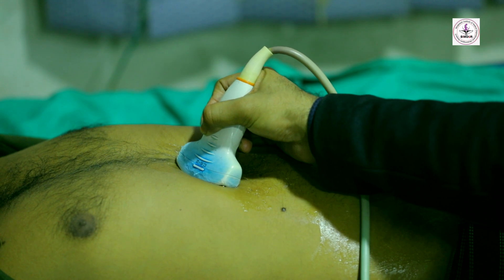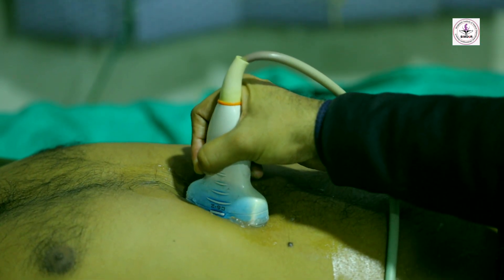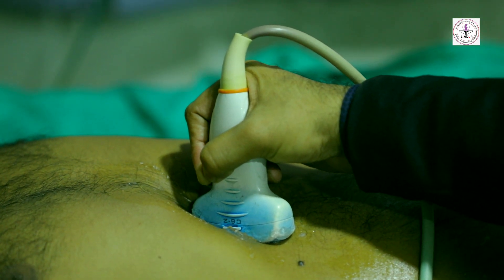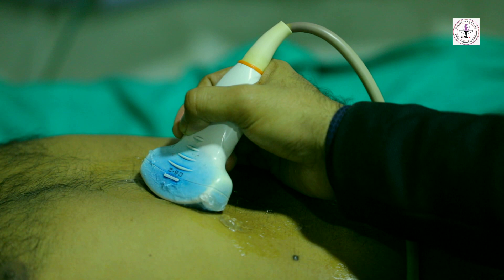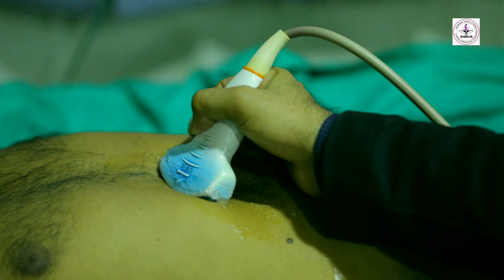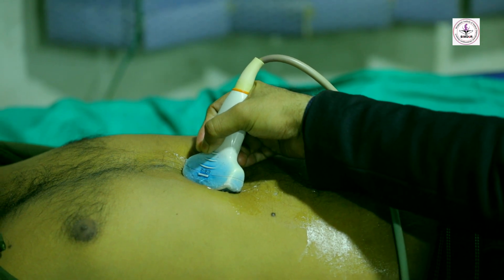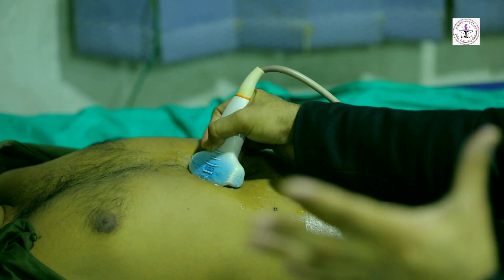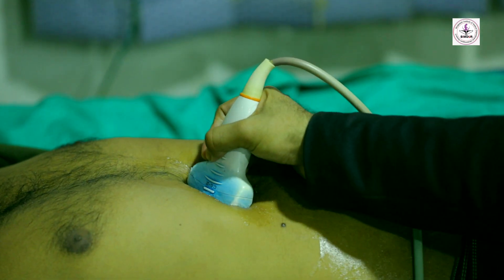When I place the probe in sagittal oblique position in the epigastric region, we can visualize the gallbladder. We can see the gallbladder fundus, neck, and body. We check the gallbladder anterior wall and posterior wall. To visualize the liver with gallbladder, patient preparation is fasting. When placing the probe, ask the patient to hold inspiration — then you can see and visualize the gallbladder and liver on screen.